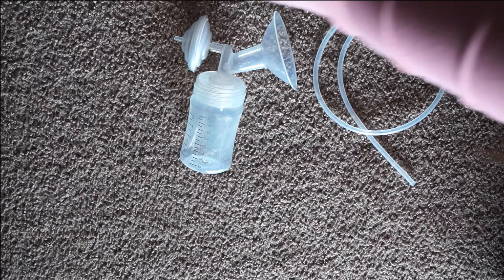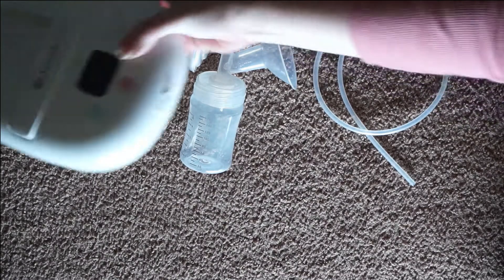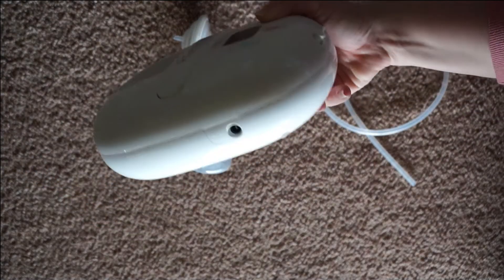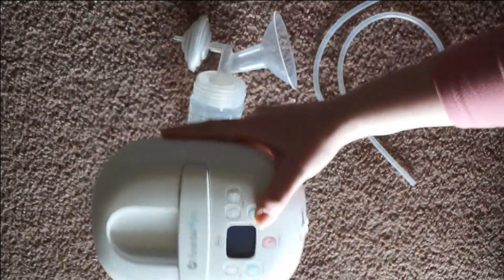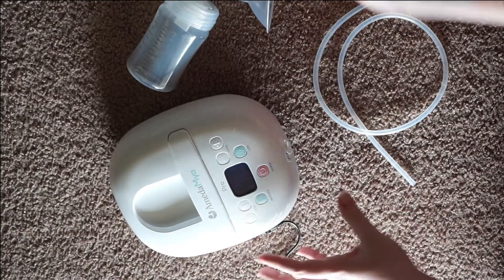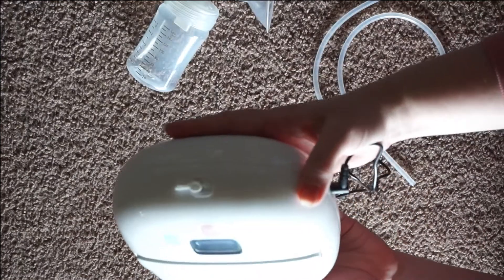Now to set everything up, I'm going to go ahead and take the motor and plug it in. Right there is your power adapter port, so just go ahead and plug that in. I already have my adapter plugged into my outlet. The tubing port is right up here in the front.